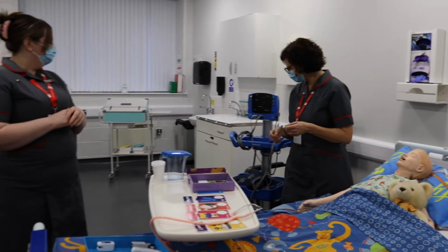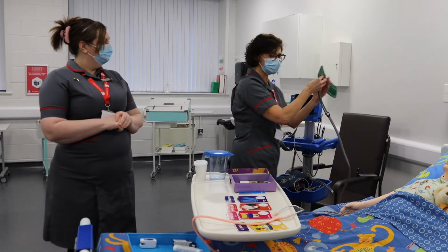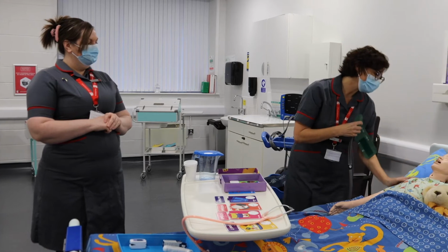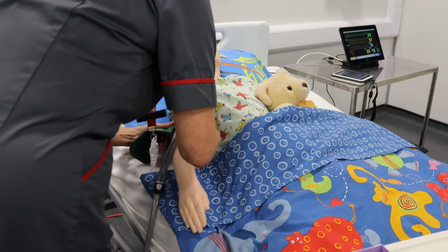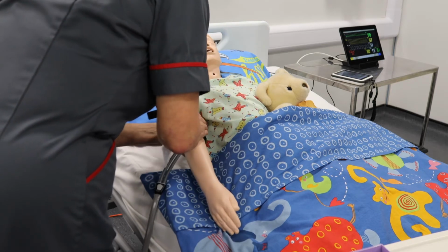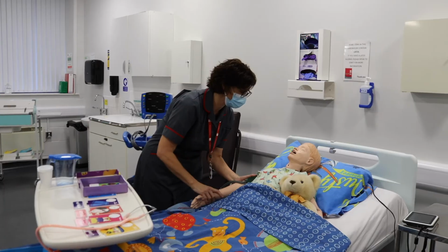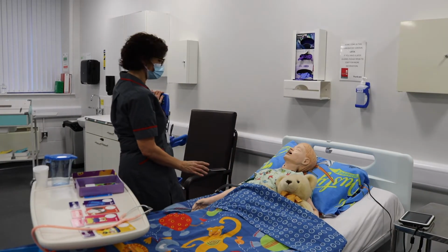Wonderful. So another thing that we can do with Sam is we can measure his blood pressure. Lorraine, would you like to measure Sam's blood pressure using the piece of machinery you've got there? Okay, we've got a blood pressure machine here called a Dynamap. Sam, I'm just going to take your blood pressure. So we'd lift Sam's sleeve up, wrap the blood pressure cuff around his arm. Okay, Sam, it might squeeze a bit, but it's all right, it won't take very long and it might make a bit of a noise.